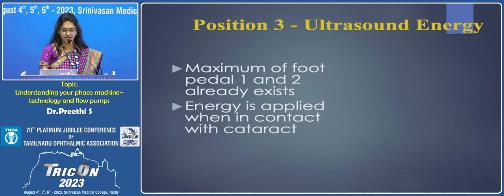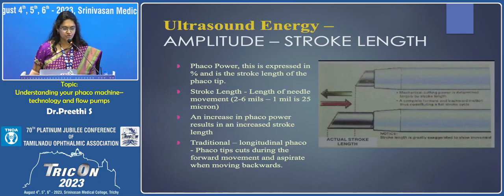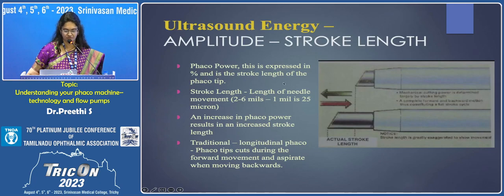So in this, maximum of foot pedal 1 and 2 will already exist. And the energy has to be applied when in contact with the cataract, so that you reduce the side effects of the same. And we should know what the stroke length is. So the phaco power is expressed in percentage, and is the stroke length of the phaco tip.